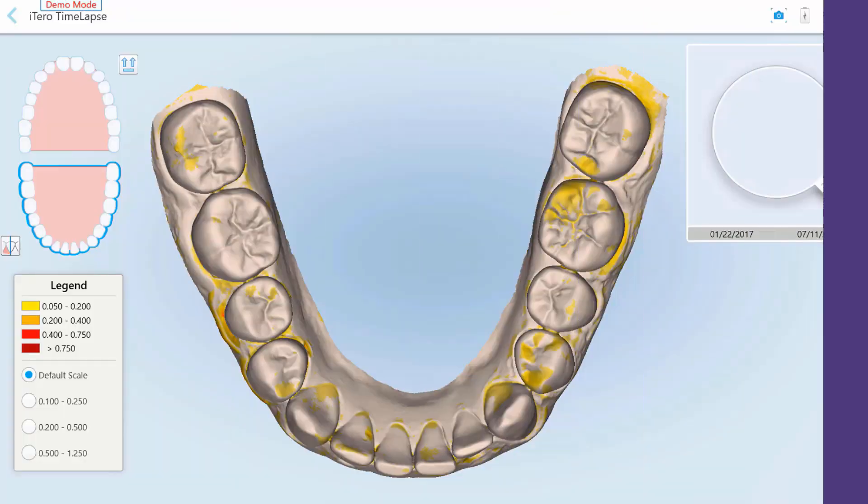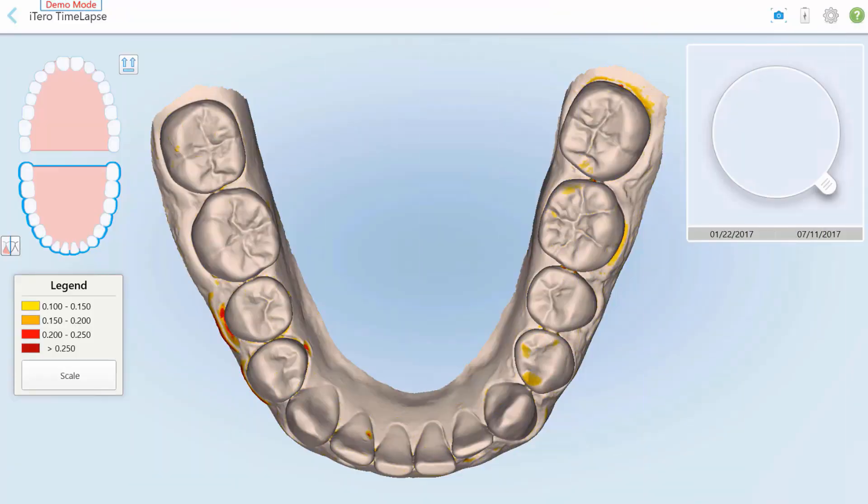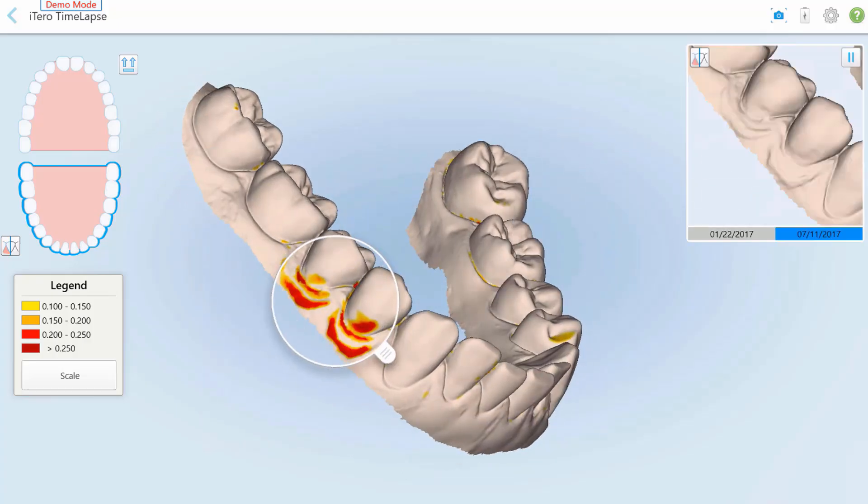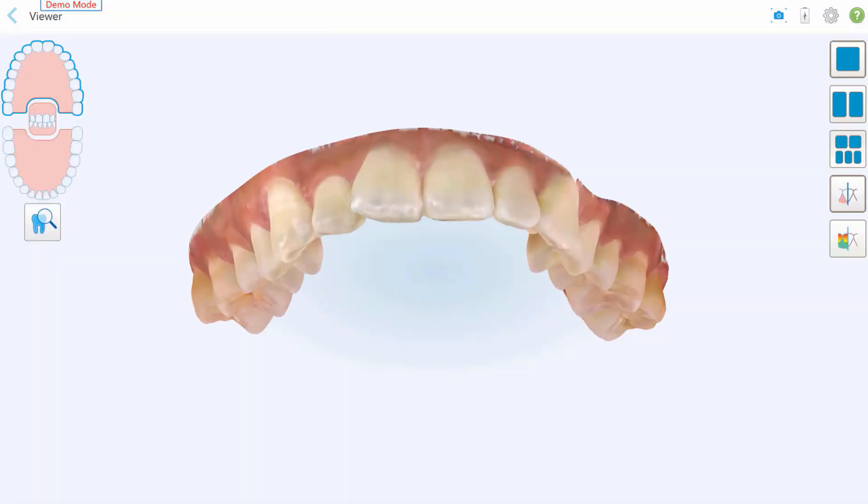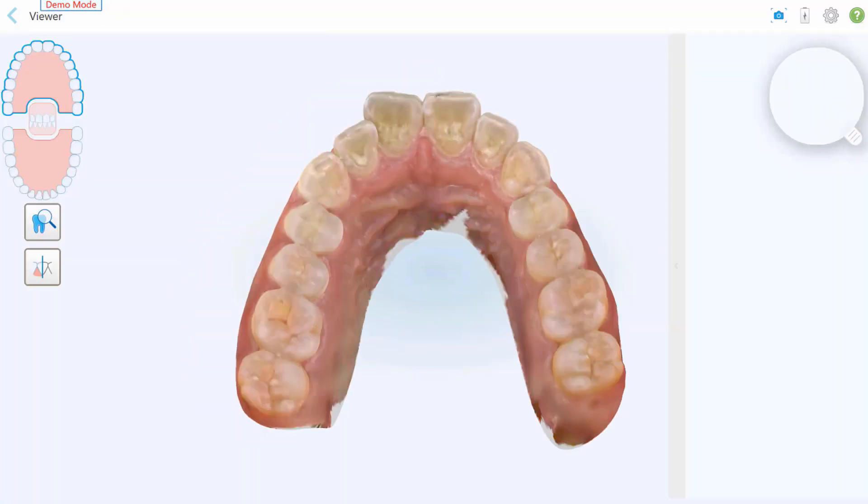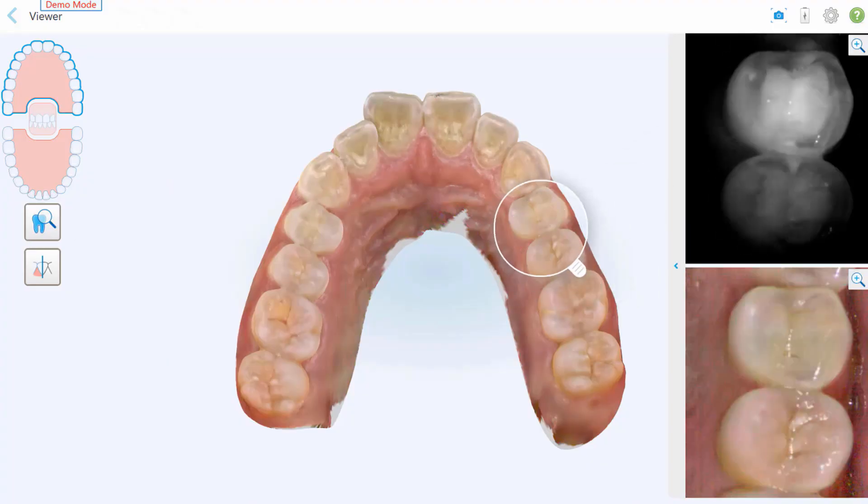Anyone in the clinic can use demo mode to become acquainted with the iTero software interface, practice scanning, and explore tools and sample cases, all in a safe environment without impacting the main patient database.